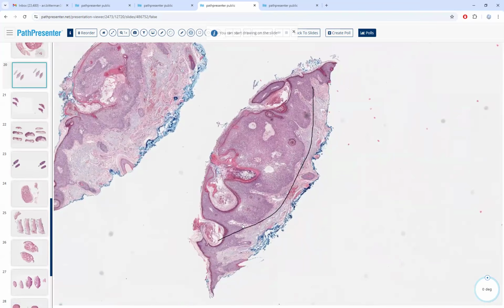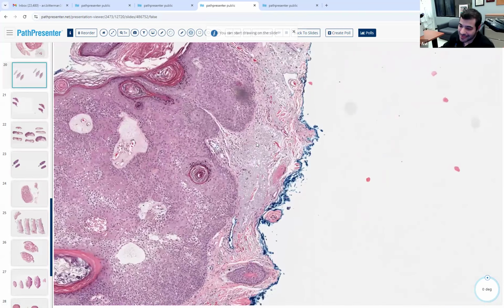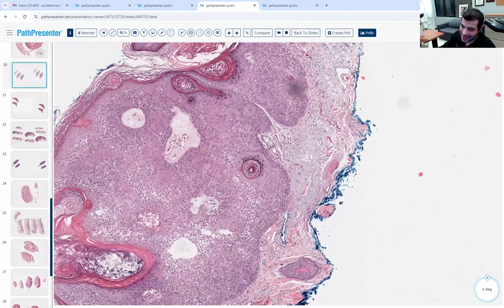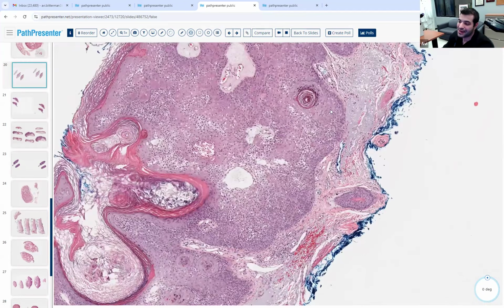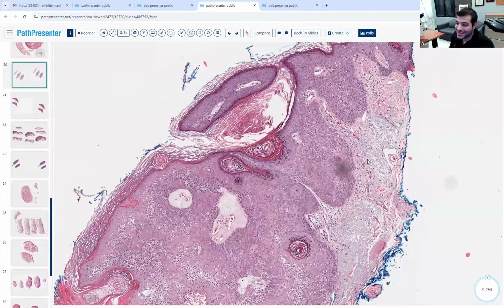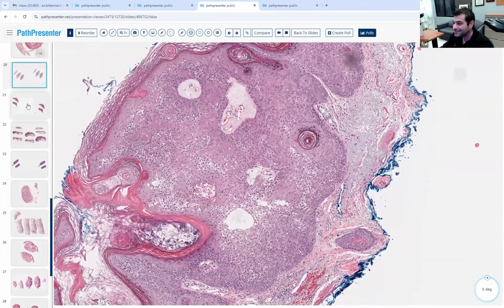Do you usually see solar elastosis in the background of this? People with sun damage can get all sorts of things. They can get sebs. They can get IFKs. Solar elastosis is a clue for certain things, so we wouldn't be surprised if he had a squame, and we wouldn't be surprised if he had an AK. But would we be surprised if someone with solar elastosis had a seb? Not really. Would we be surprised if he had an IFK? Not really.